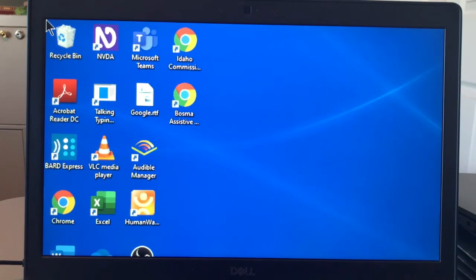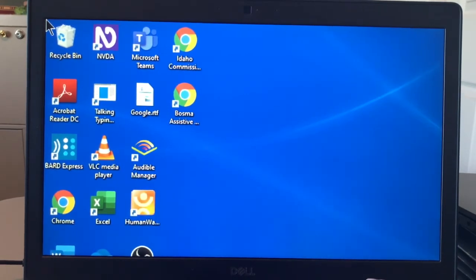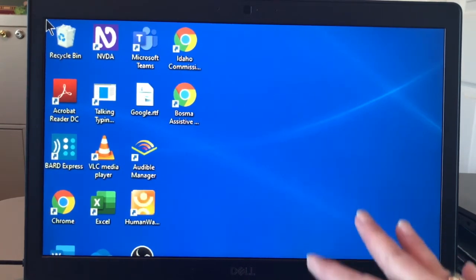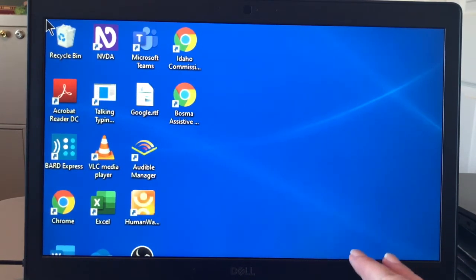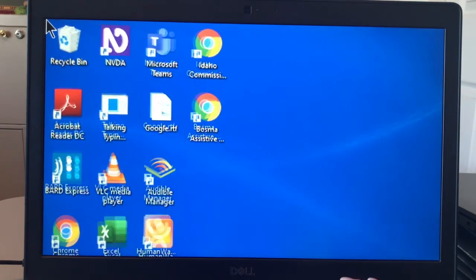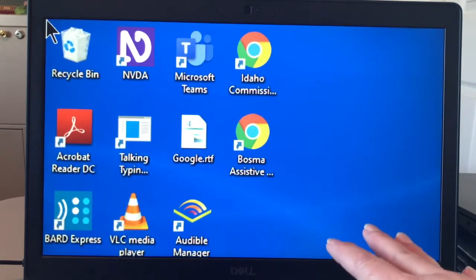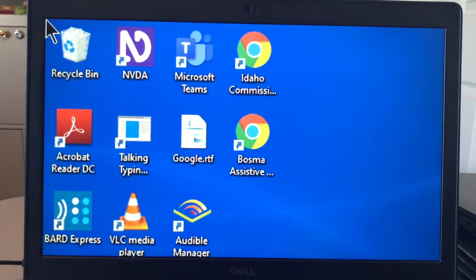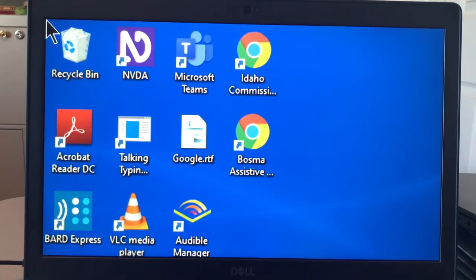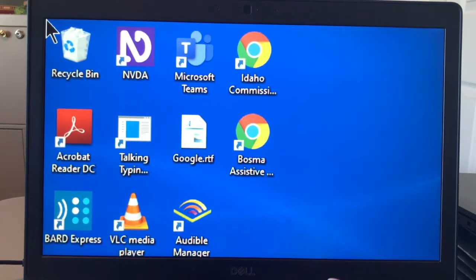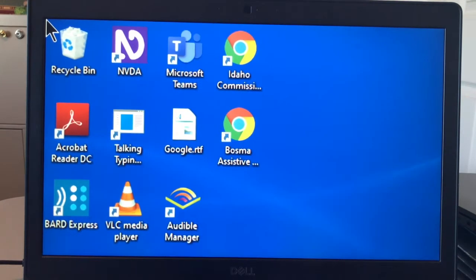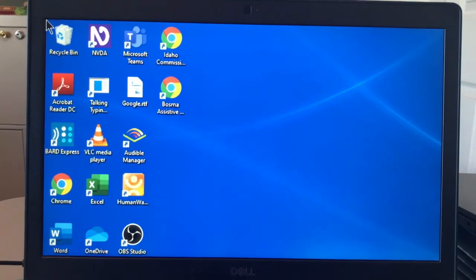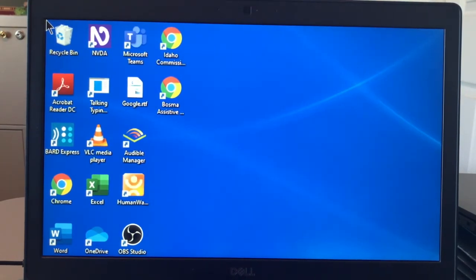If I wanted to zoom up in magnification, I hold down the Windows key, and hold down the plus key. When I lift up the plus key, it will stop at that magnification level. Same thing with decreasing magnification. I can zoom down in magnification by holding down the Windows key, and holding down the minus key. Lifting up my finger off the minus key, and it stops at that magnification level.